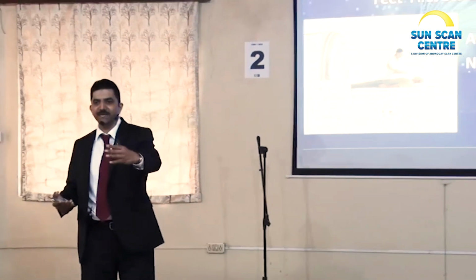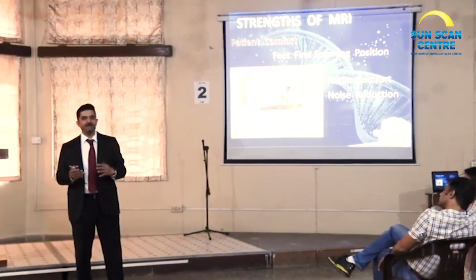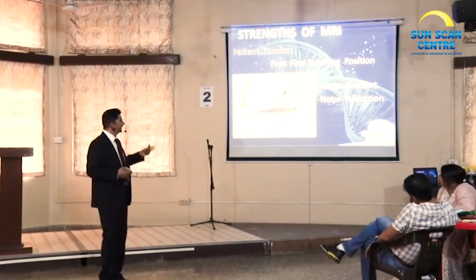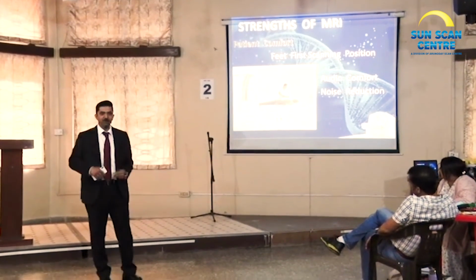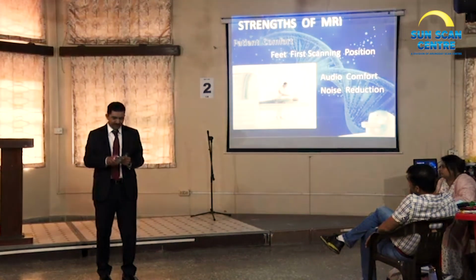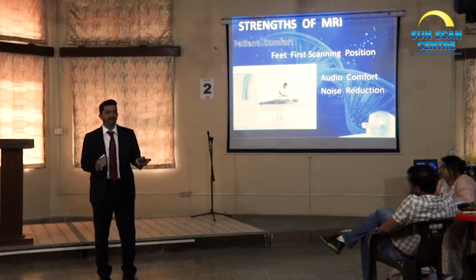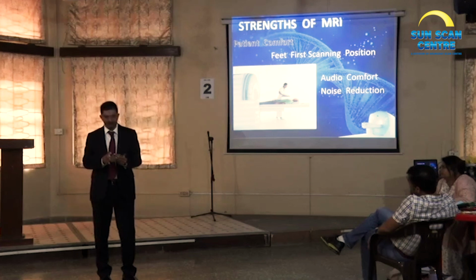And of course, if you are undergoing a scan hip below, so if you are undergoing a hip MRI, a thigh or knee or ankle MRI, you can be put inside with feet first. Your feet go inside and your head remains out. So that's completely fine. Then there's also audio comfort, like the sound of the MR itself is now reduced, so that the patients don't have much of a problem. And even you could have headphones now, so you can listen to your favorite songs while you are undergoing the MR, which is reality.